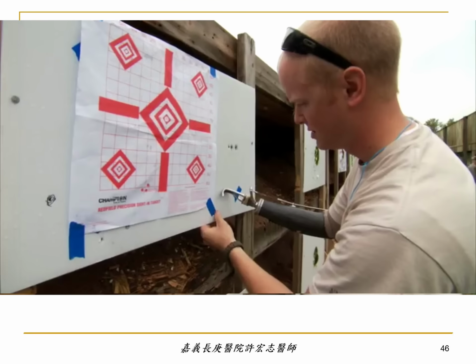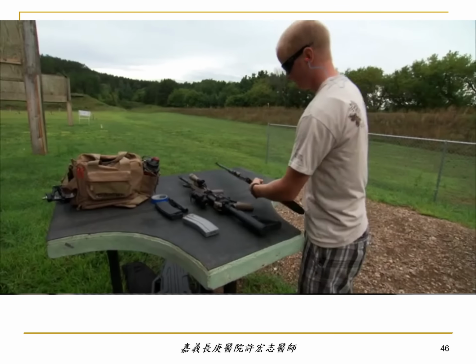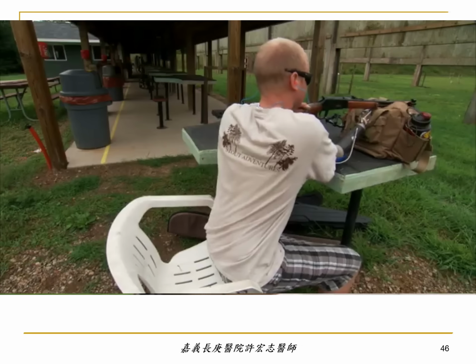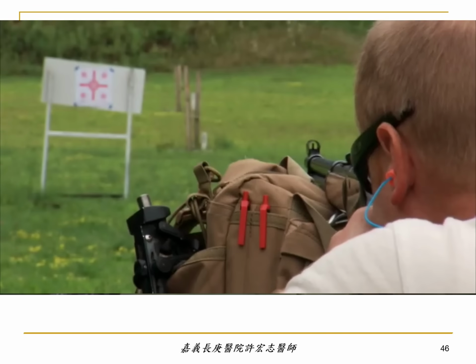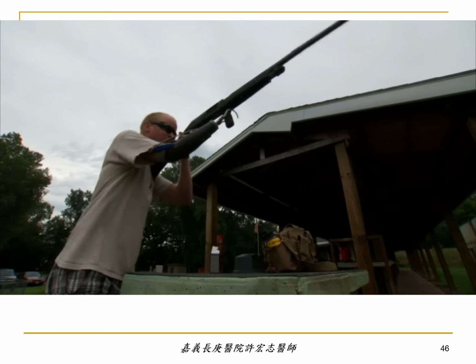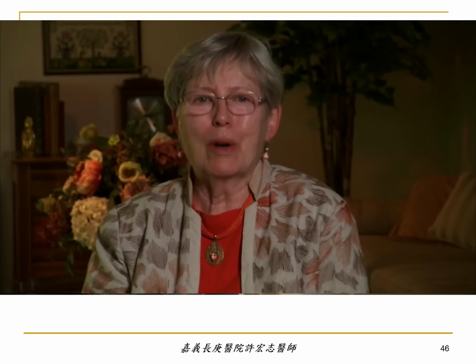I always loved hunting and target shooting. Right away from the beginning, I figured I still want to do this. I'm going to find a way. We took some parachute cord and put a little loop on it that I could grab with my prosthesis, and I could then have more control of the gun. I was able to modify the pump on my shotgun, and that way I was able to chamber new shells into it. I can do whatever I want to do.